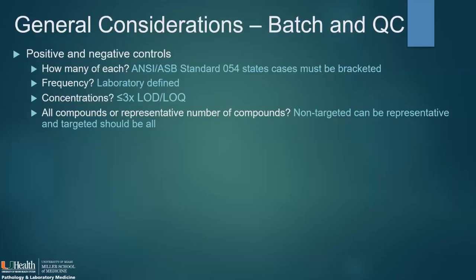I would once again like to say, as I mentioned for frequency, this is laboratory defined. The information that I'm pulling is from ANSI ASB Standard 54, but it's laboratories' decisions on how they implement that. So this is what I'm pulling from the standard, but please do keep in mind where I'm getting these answers from and what I am trying to convey.